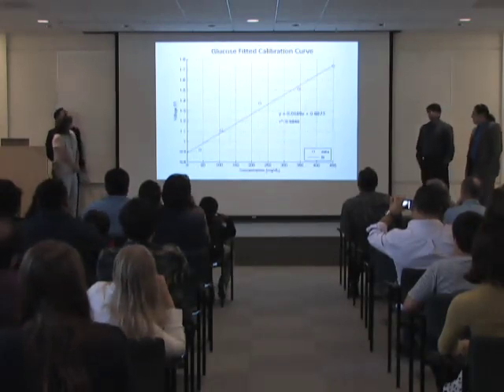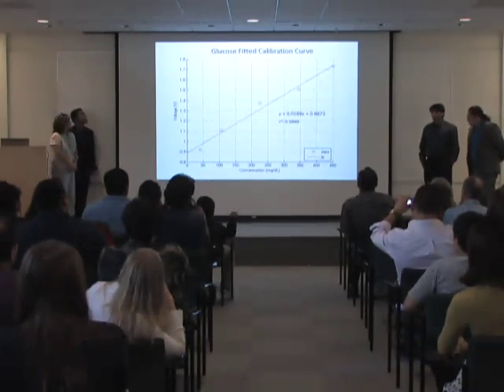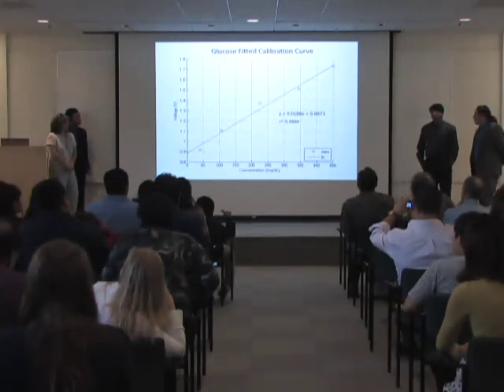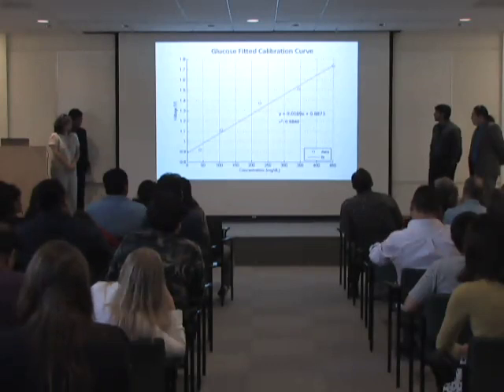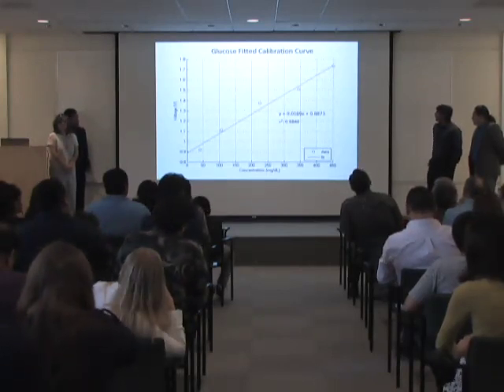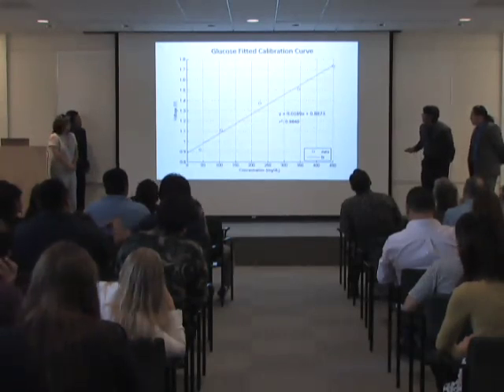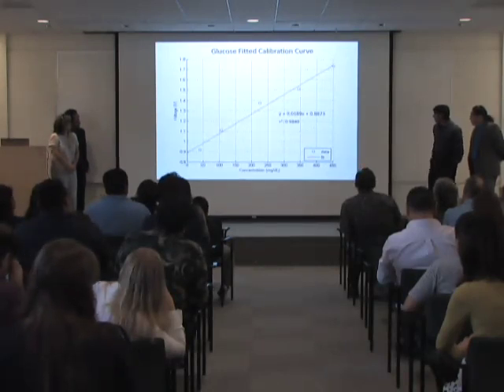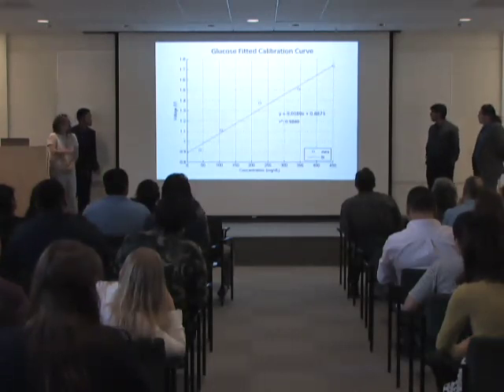Okay, so we have a peak voltage now, but we want to convert it into a glucose concentration. Because when the glucose monitor generates a reading, it's not going to give it in volts, it's going to give it in glucose concentration. So how do we convert the two? Well, it's actually a process called calibration. So basically, for example, if my peak voltage is, say, 1.5, that corresponds to a glucose reading of 350 milligrams per deciliter. And that's the reading that will show up on the glucose meter.